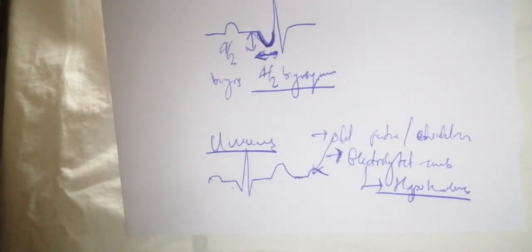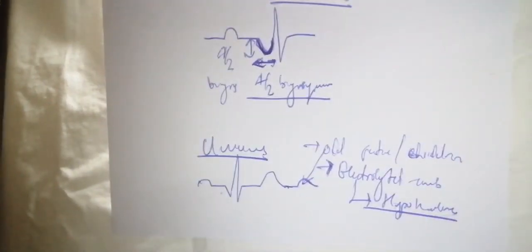So those are the different things that you have to visualize on a physiologic ECG interpretation. Now, the last element of the physiologic ECG interpretation is your summary or your conclusion. In order for you to conclude, you write all the major elements of your ECG interpretation on your paper, and then you conclude with a pathology of the ECG. So those are the different elements that you have to understand when you're doing a physiologic ECG interpretation. From here we now move up to the next point, that is a pathologic ECG interpretation.